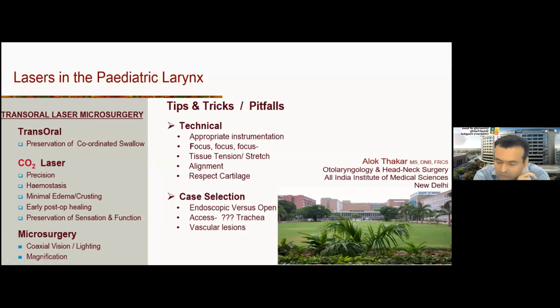For laryngeal clefts, lasers are great. The only issue with using lasers in laryngeal clefts is if it's a revision laryngeal cleft and the tissues become pretty friable at the edges. Sometimes the laser is not the best tool, and then you end up using cold steel instrumentation. One of the things which I really like using laser for is post-open airway procedures. If you have a little bit of granulation tissue, you can spot laser it. It's easy to do. You're not pulling at tissues. You're not trying to remove tissues which you don't want to remove.